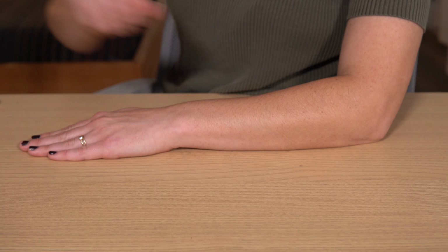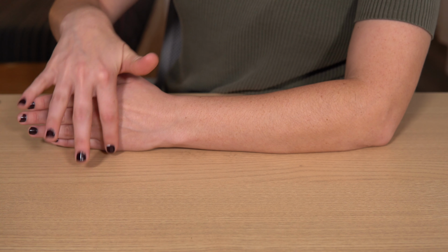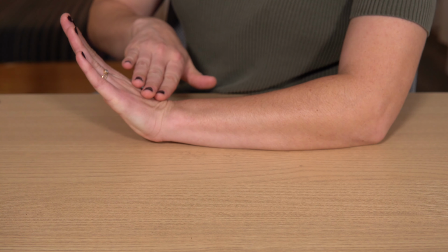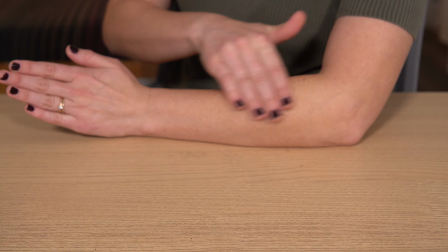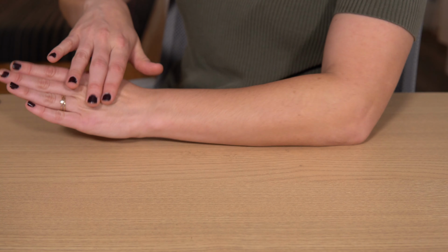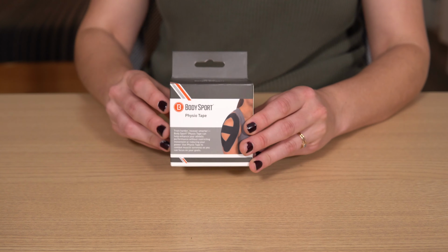So to start off, let's talk about where we're going to place our K-tape. The first anchoring point, or starting point, is going to be right below the knuckles on your hand. The second is going to be on the outer edge of your elbow. And that's because that's where our wrist extensors insert.